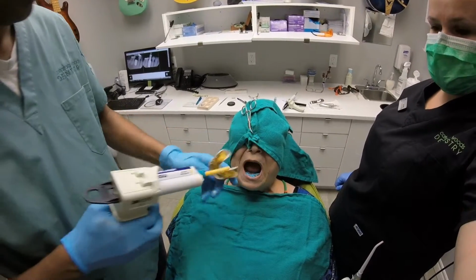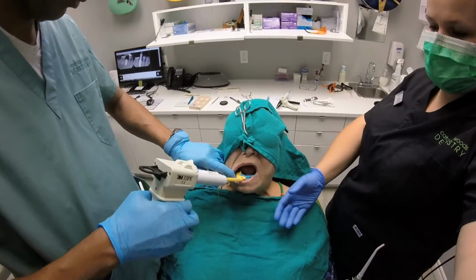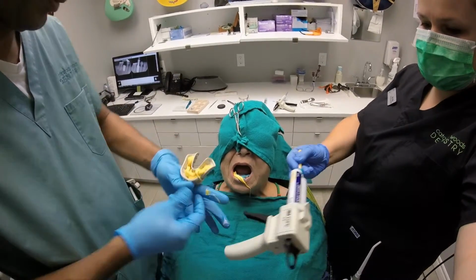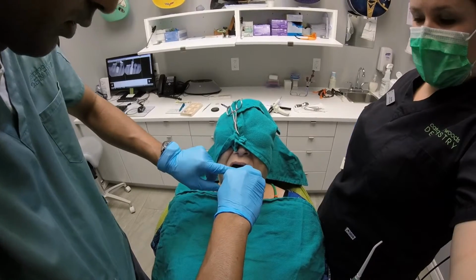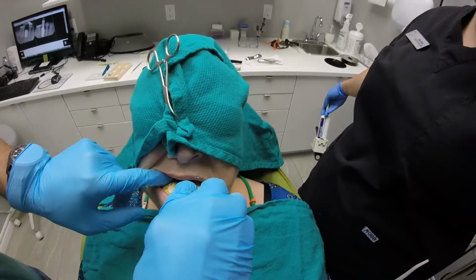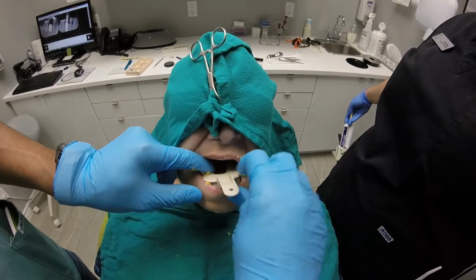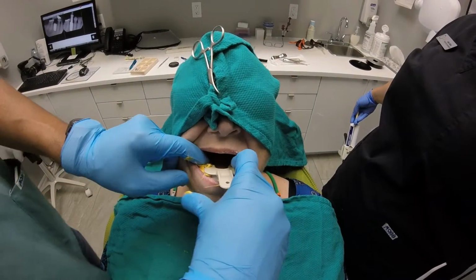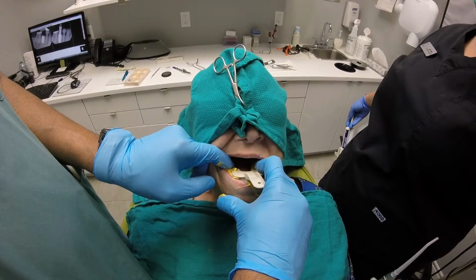Some people say don't use light body because it's not firm enough to hold the transfer copings, that you can end up getting lab error and stuff. Well, the problem with not using light body is, have you ever tried taking an impression with just heavy body? Do it sometime. You get absolutely no detail on the teeth. And without detail, you end up giving your lab poor information. Poor impression, poor information. Lab doesn't get information, you get back a garbage product.